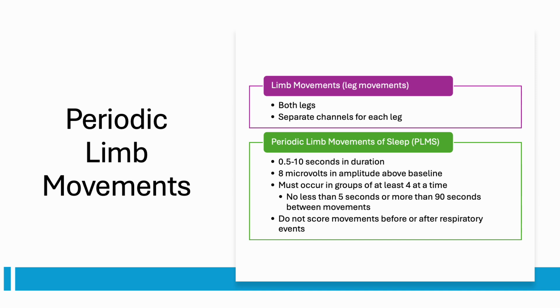All the other disorders are usually just documented in the study when they happen. However, some sleep software does allow the scoring of all these different disorders, but most don't, because it's not something that you put in a report as far as what the doctor will put in there. It depends on your lab's policy and procedure and ultimately what is shown on the report.